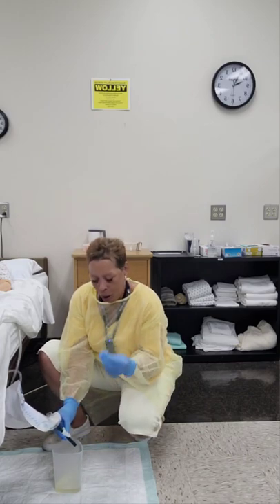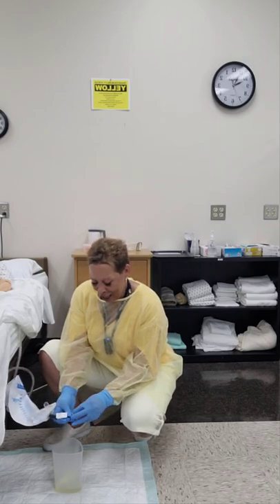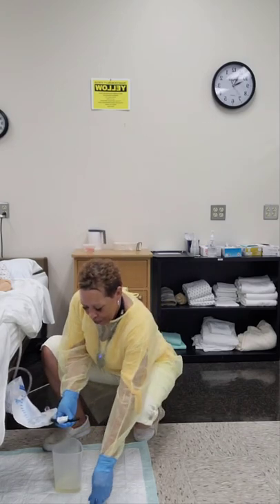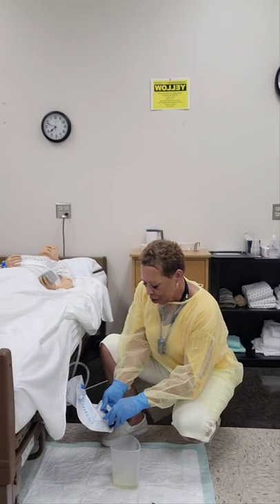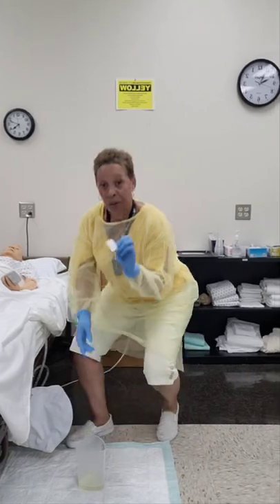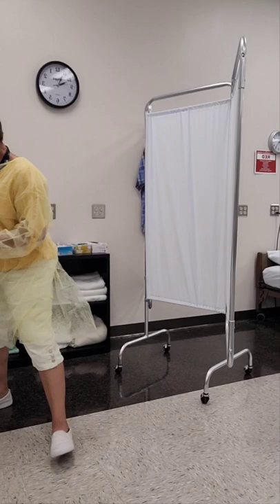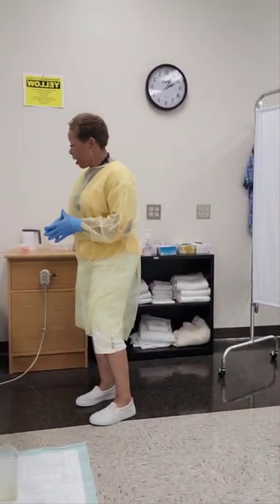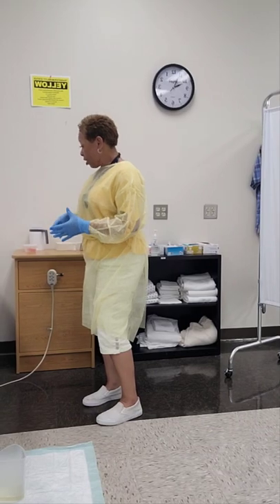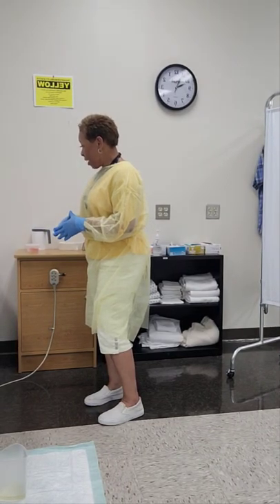Then I'm going to take my alcohol wipe and clean the outside edges of the drainage tube. Once I do that, I'll place the drainage tube back into the holster and throw away my trash. Mrs. Jones, I've emptied your drainage bag. Now I'm going to go measure and record your urinary output. Is there anything I can do for you before I leave?